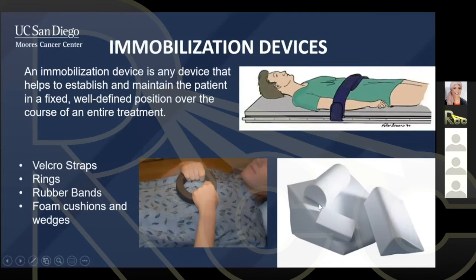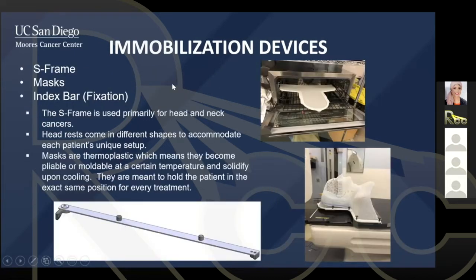These are mainly for patient comfort, or if we're trying to achieve a certain position, we might put one of these devices underneath a patient's back to elevate them more. But they're mainly for comfort, and also reproducibility. We also treat a lot of head and neck patients.